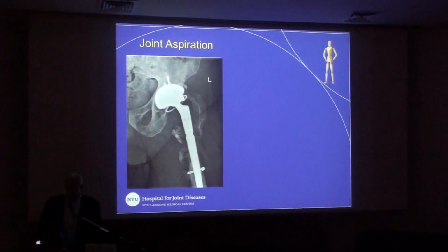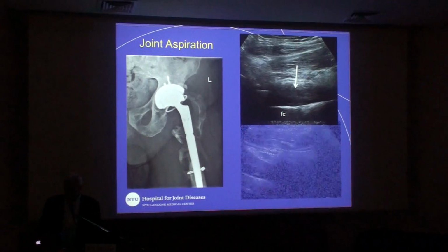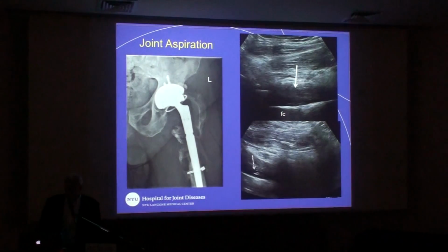Finally, we have this patient who has obvious osteolysis around their arthroplasty. And you can see there's a fairly thickened anterior recess, and there's a femoral component sitting over there, so it doesn't affect our ability to see that complex fluid. There's my needle going into it. There's the tip indicated over there. We got 45 cc's of purulent material out of that joint. So again, it didn't affect our ability to do this aspiration, and we could give the clinician an answer almost immediately.